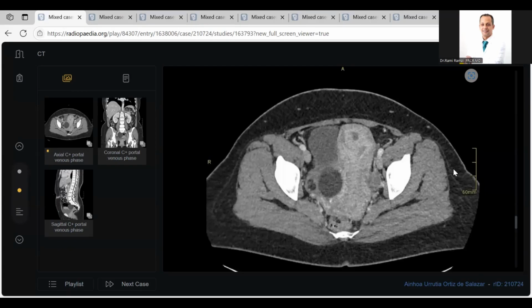What other complication could be of dermoid cyst? Ruptured dermoid. That's why I said there is no evidence of fat within the peritoneum. It will cause chemical peritonitis. Thank you, doctor, so much. My interpretation: this is a non-complicated dermoid tumor within the right ovary. Thank you so much. You did very well.